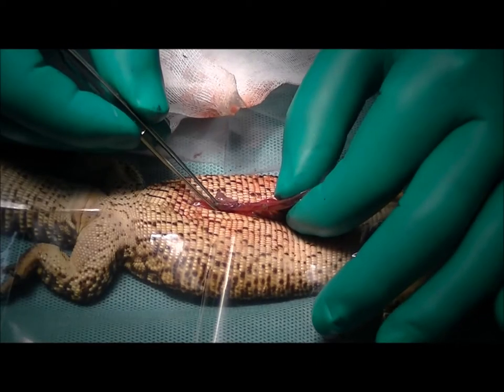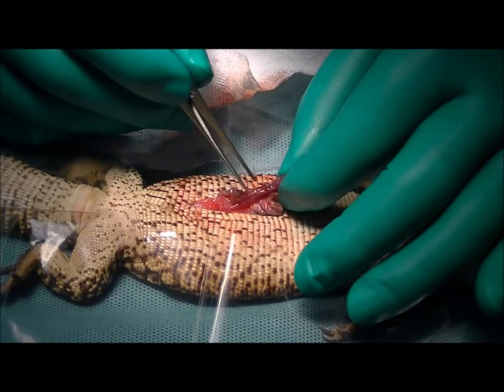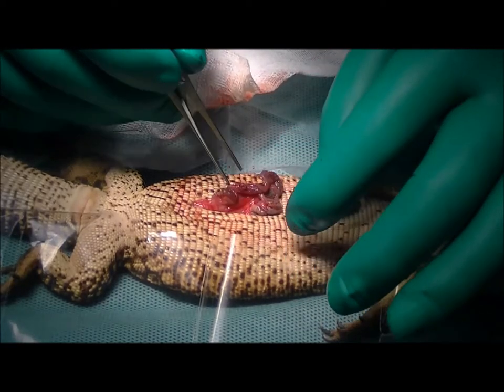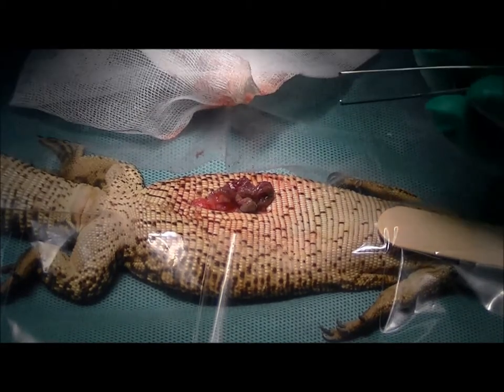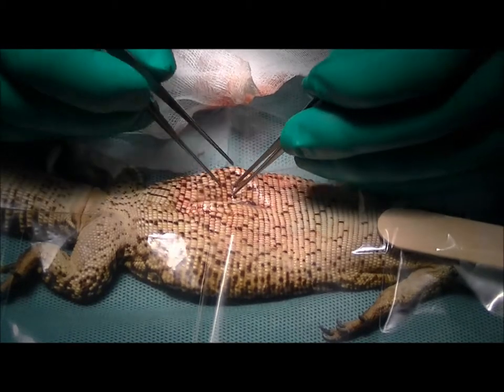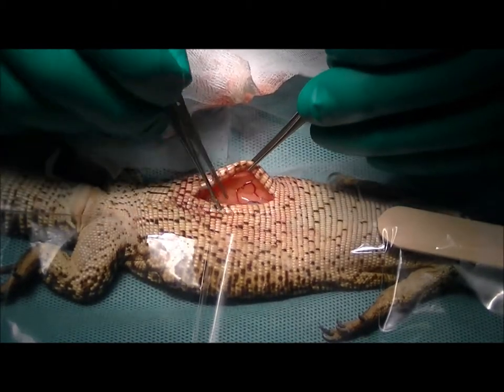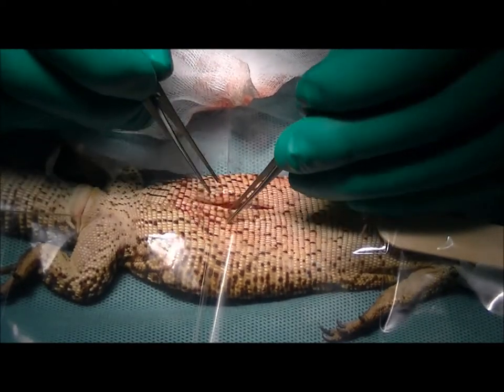I've put a couple of stitches in the wall of the uterus to close that hole over. That should seal nicely — she should really have no problems breeding next season. We've certainly had lizards who've had this procedure done and gone on to have normal reproductive efficiency. We'll go ahead now and close up this abdominal cavity and wake her up.